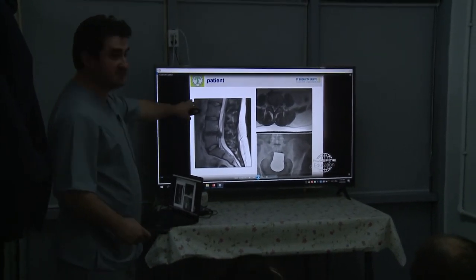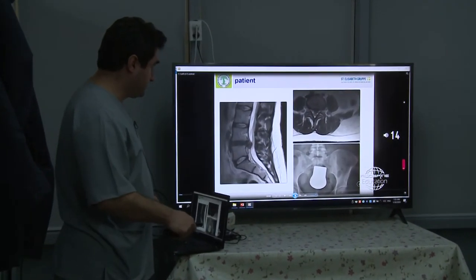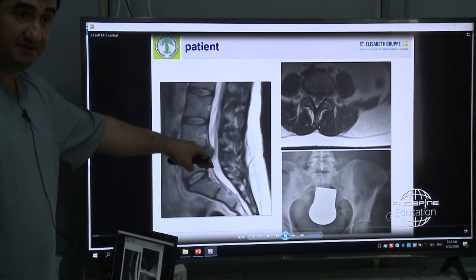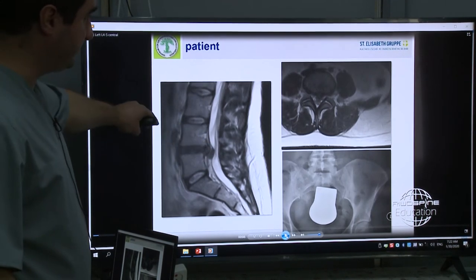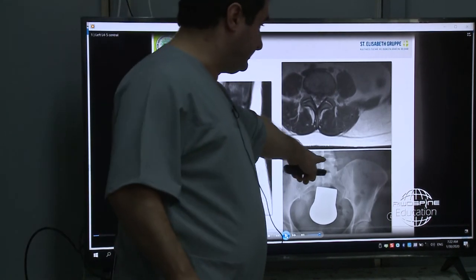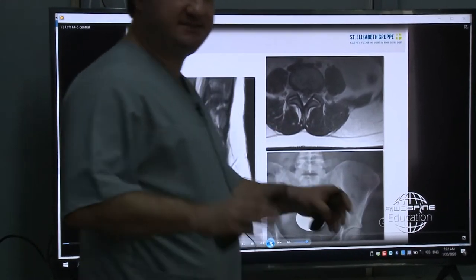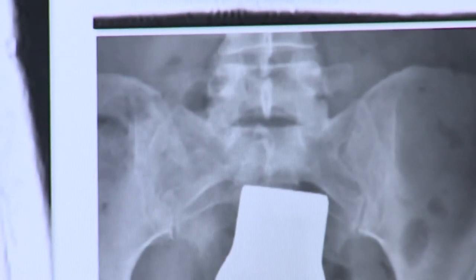Okay, let's look at this case. You see the herniation is almost on the disc level. It's not caudal, or a little bit caudal, but it's enough. It's between the indication criteria. And also, if you look at the foramen here, it's free. This is between the indication criteria of the transforaminal approach, and really good to start with this approach.